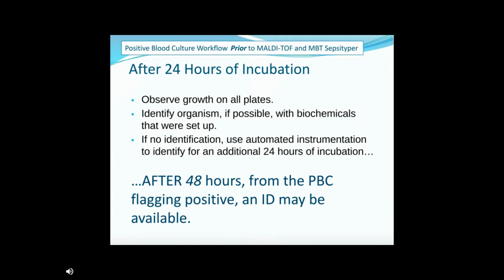So at the 24-hour mark, we're going to let that incubate for 24 hours, we would look at the plate, the growth on the plates, and if we were able to identify the organism at this time, then we would phone that to the floor. We would give them an update to let them know what grew out.